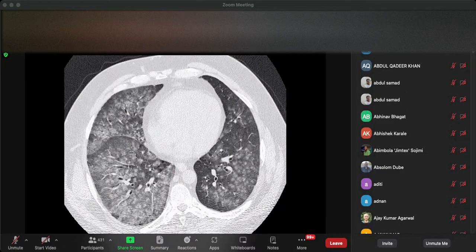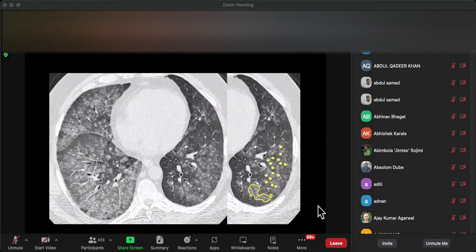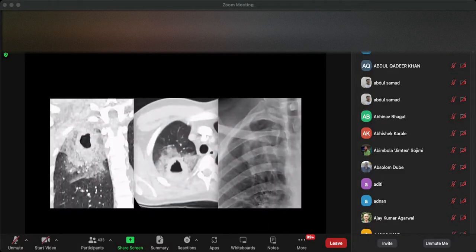Really a good example of nodules, and the nodules are in which part of the lung? They're all well ordered, and yeah, so particularly in this part here, you've got little dots which are coalescing, becoming fluffy, and they're all equidistant, because they are in the center of the secondary pulmonary lobule. Okay, there's an area where there's a bit more coalescing, but these are all separate dots.